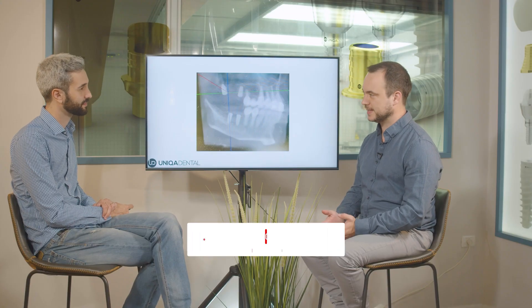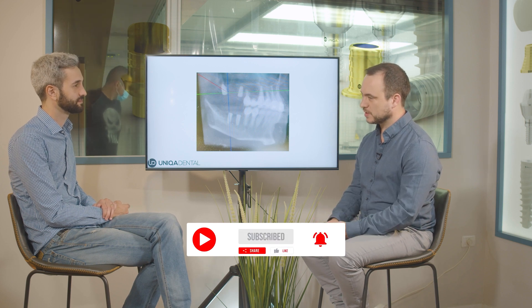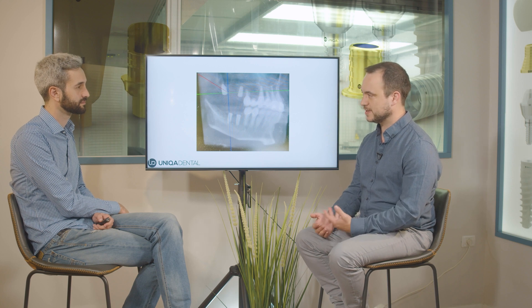Today we have a case where we're planning the extractions and implantations. We want to plan everything accordingly so we'll have the option to be minimally invasive and have the best possible temporary solutions for this case.